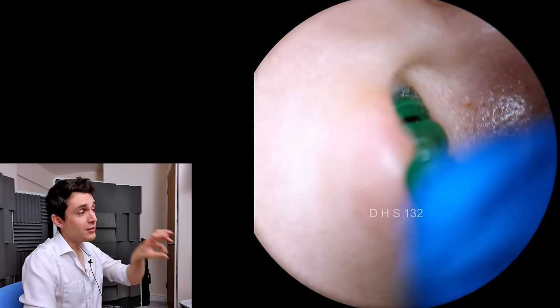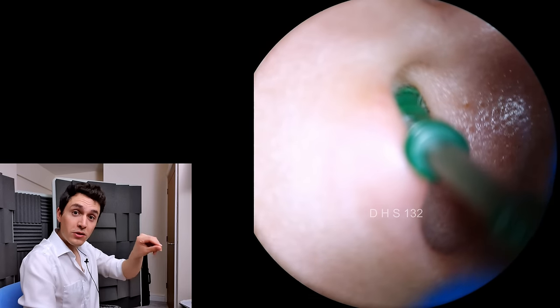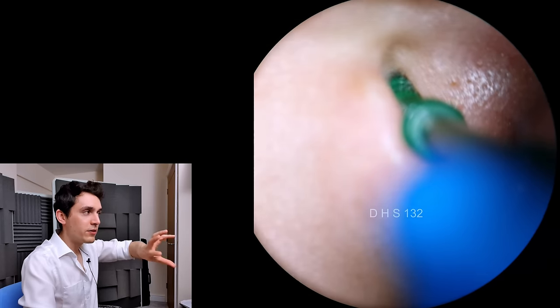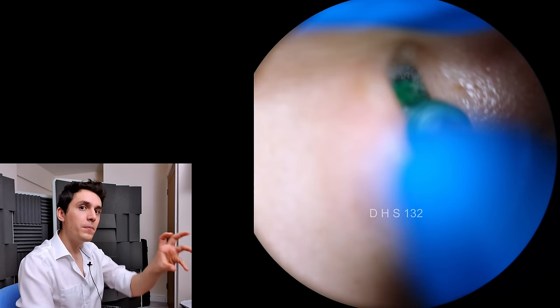What you're supposed to do is, as you advance it into the ear canal, you're supposed to turn it very slowly clockwise. What it's doing is it's kind of spiraling around and enveloping the wax.